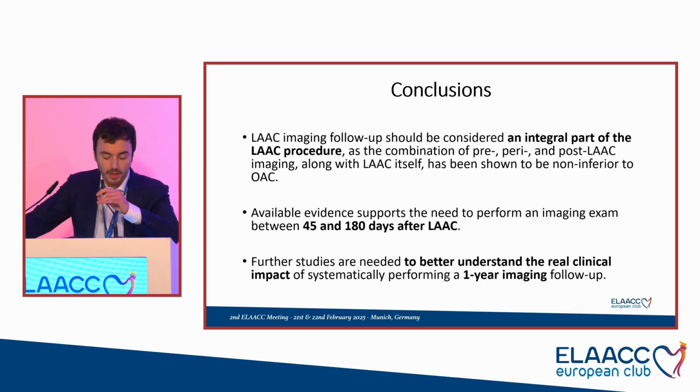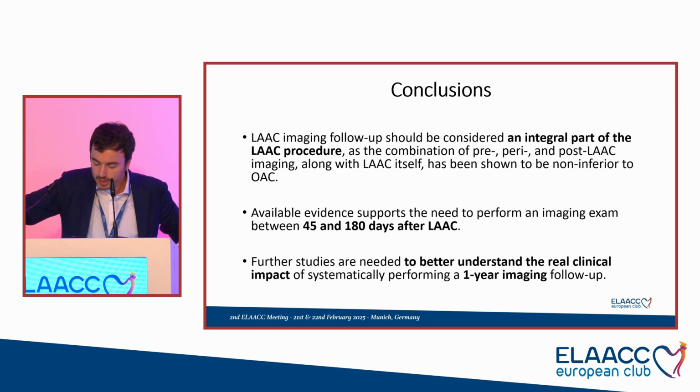So, in conclusion, LAAC imaging follow-up should be considered an integral part of the LAAC procedure, as the combination of pre-, peri-, and post-LAAC imaging, along with LAAC itself, has been shown to be non-inferior to OAC. Available evidence supports the need to perform an imaging exam between 45 days and 180 days after procedure, and further studies are needed to better understand the real clinical impact of systematically performing a 1-year imaging follow-up. And thank you very much for your kind attention.